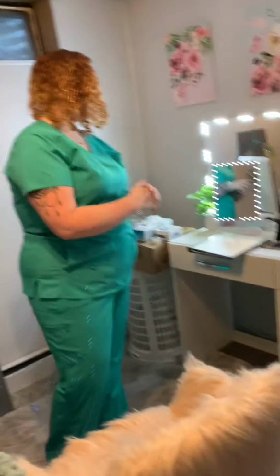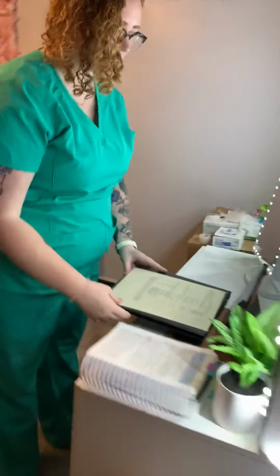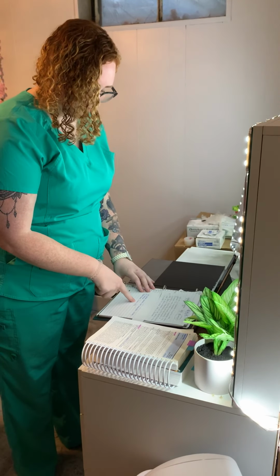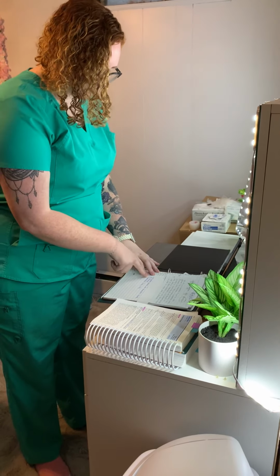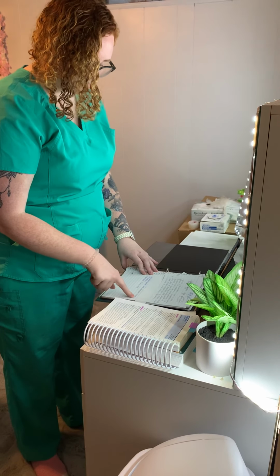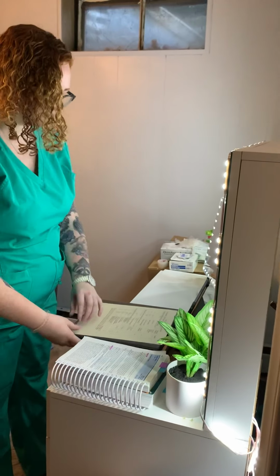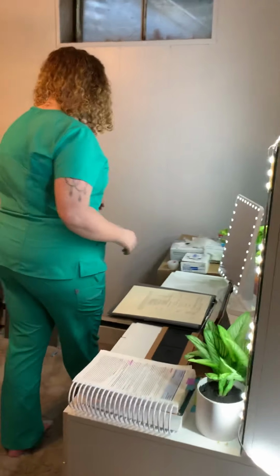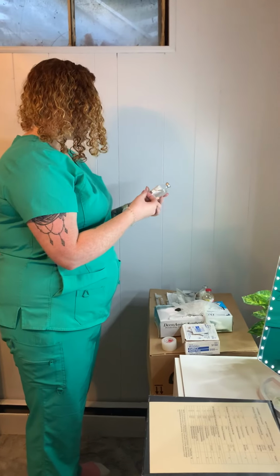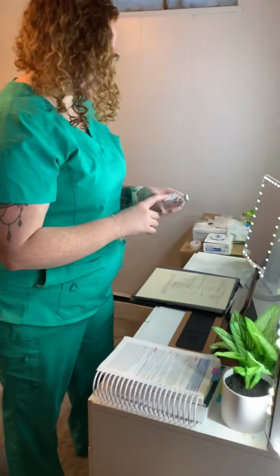I will wash my hands, go to the med room, and get my patient chart to compare to the MAR. Ordered is famotidine 20 milligrams IV piggyback. Running is 0.9% sodium chloride with phenytoin 100 milligrams at 125 mL per hour. Going to the Pyxis, I will remove my famotidine and scan it as the first med check. The second med check will be against the MAR manually.